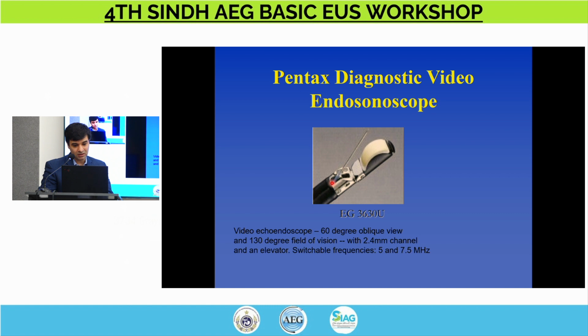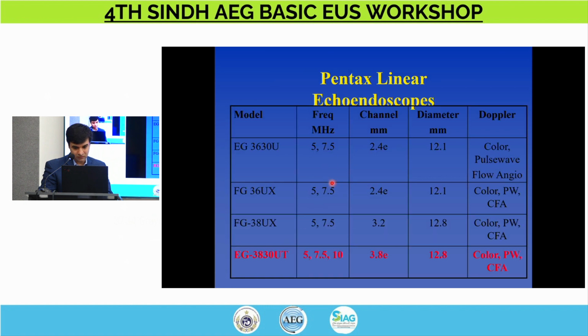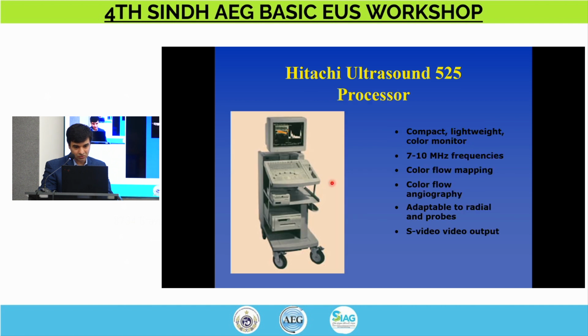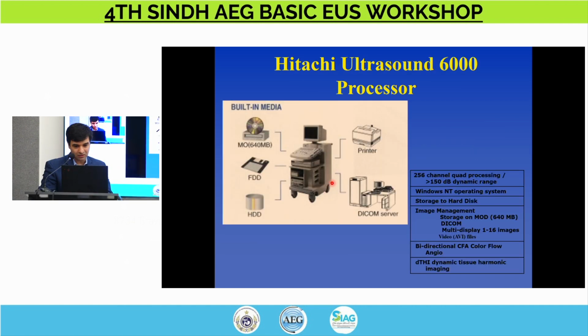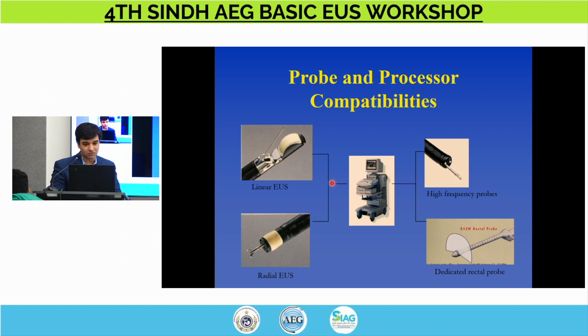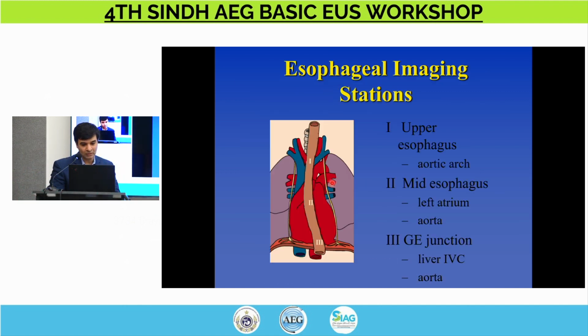Now, I'll quickly move forward with this. Now, these are just different instruments that we'll talk about. Here is a compatible central unit that you use to convert those ultrasound waves to an image. There are different ones. Here we use the Olympus. And I'll quickly come to imaging stations.